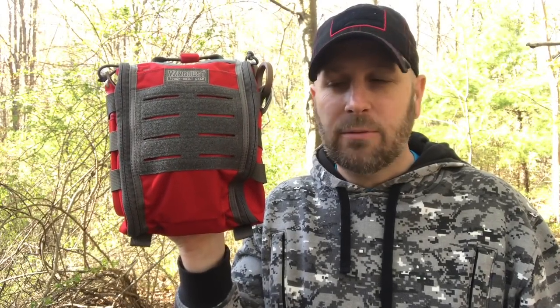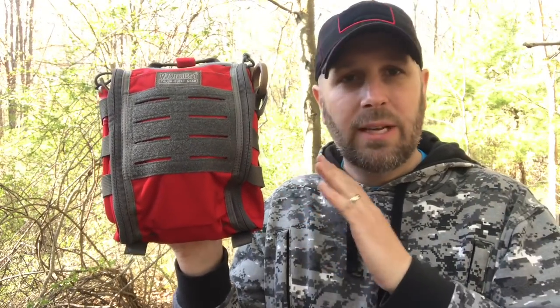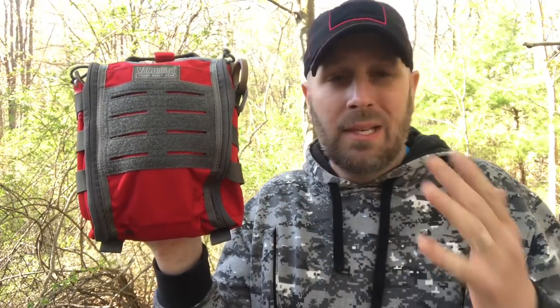Hey what's up everyone, Tim here from Everyday Tactical Vids. Today we're going to talk about this, which is a med kit I've built into the new 7x10 fat pack from VanQuest. This is considered a Gen 2 fat pack. Basically a lot of people have used their organizational pouches to build med kits, and so they finally said let's put it in red because a lot of people want that for medical purposes.